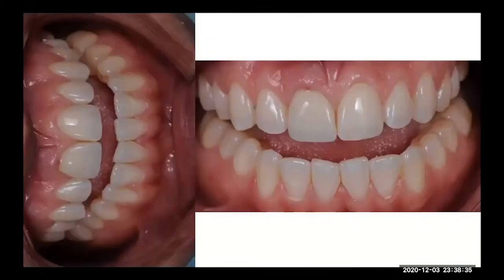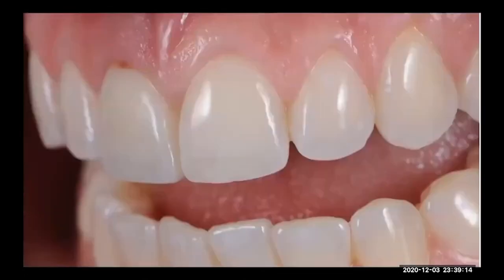You can see different angles, all the incisal movement, all the incisal colors are there. It's something that we need to learn, how to pick the right ingot to stay close to the single restoration. Like I said before, making 6 veneers or 8 veneers is kind of easy, but when you need to match one tooth and don't do the buildup the way we normally do, using 13, 14 powders, it's really hard. But we can do it if we have a good eye. If we train the eye, we can get nice results.